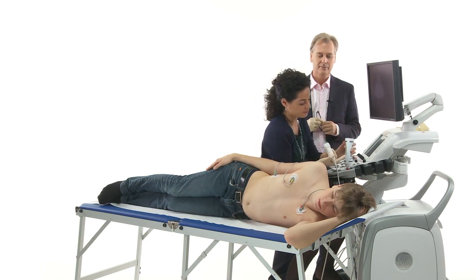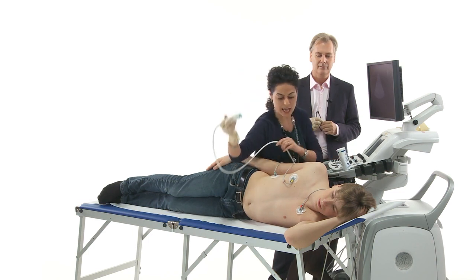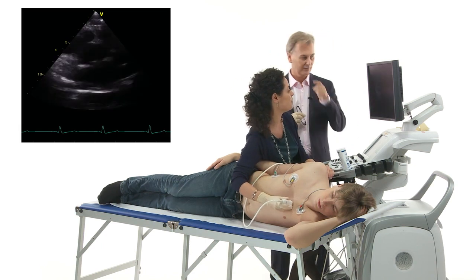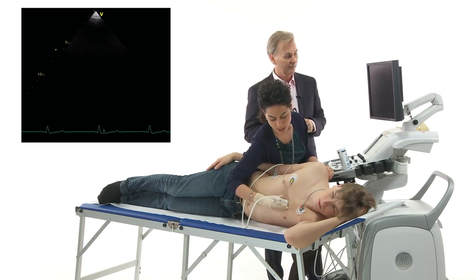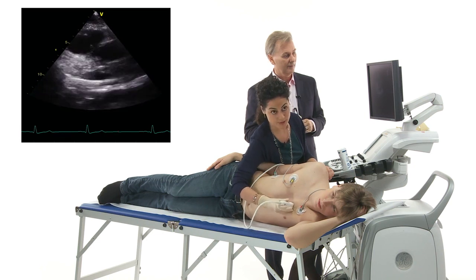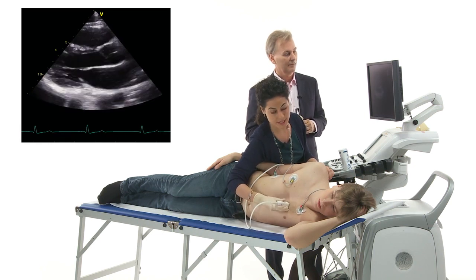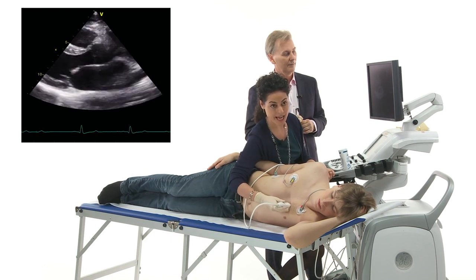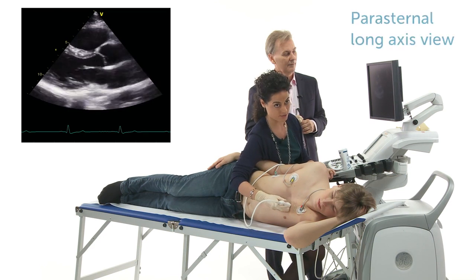Our patient, you can see, already has his left arm under his head. It's important to always get good images. We put the transducer again on the left part of his chest. We are using the parasternal approach. You already learned about it in the previous section, but now we are using the long axis view. Okay, Anna, stop.